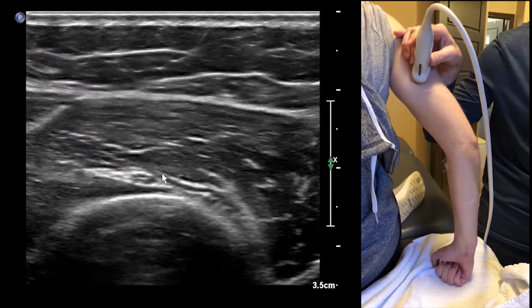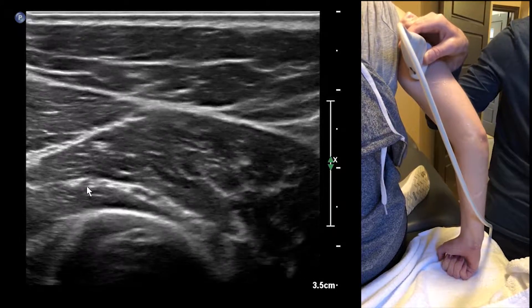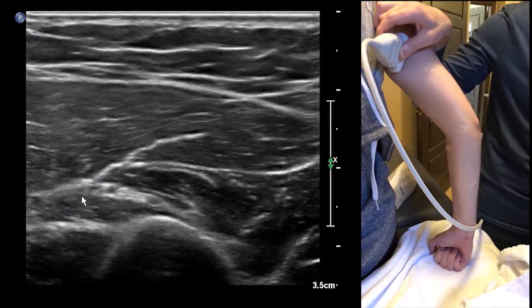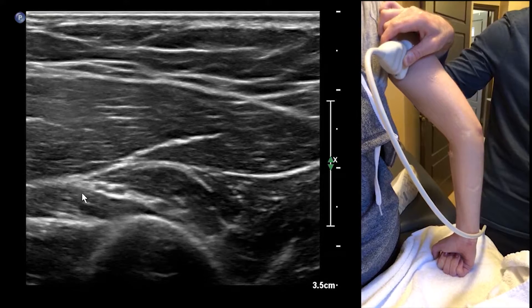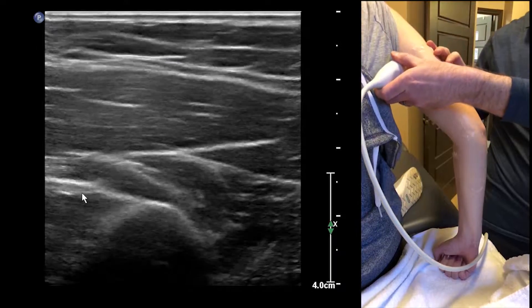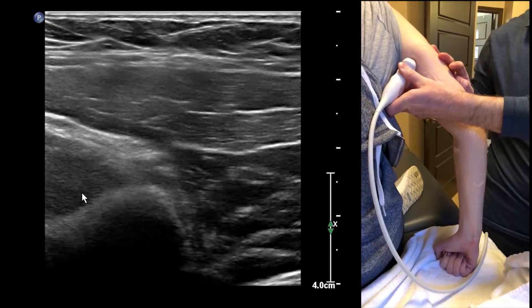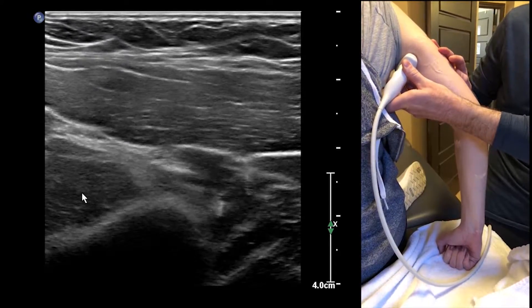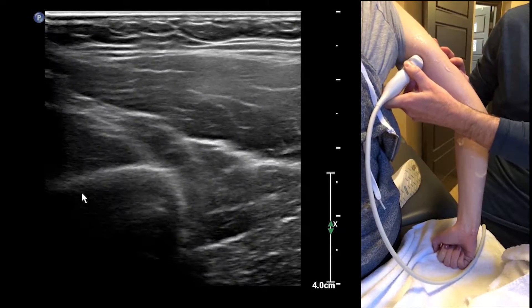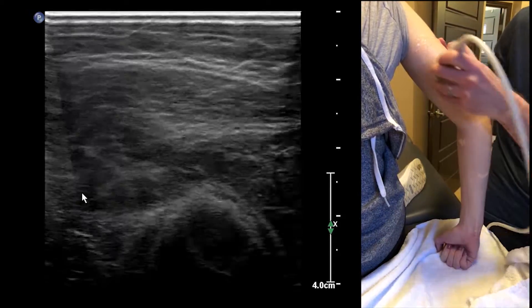Here we can see a little fascicular branch right there. Here's an artery, this is it here, and then we're going to come all the way around. I don't have enough gel here — anyway, we'll get over to the plexus in a second, so let's put some more gel on.